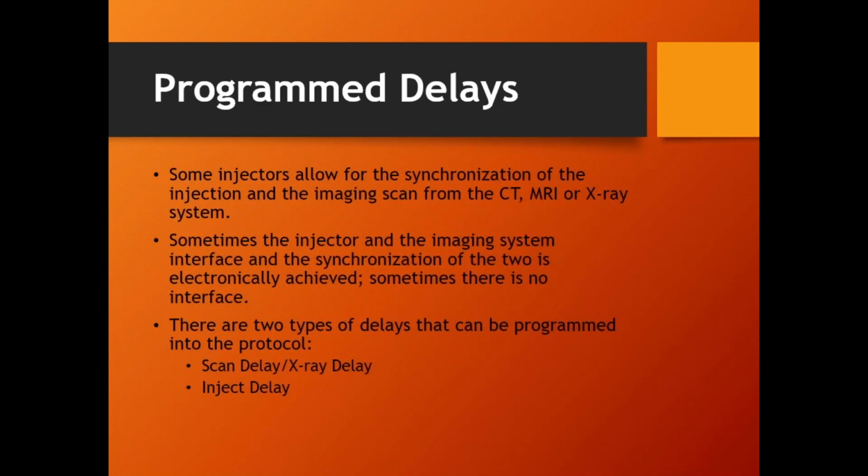Delays. So the contrast injector, remember there's the contrast injector and there's the imaging system, whether it's angio, CT, or MRI. We don't always want the two of them to start at the same time, all right? Sometimes we do. I want the X-ray system or the imaging system to start doing its thing, and I want the injector to start doing its thing simultaneously, but sometimes they don't. As a matter of fact, most of the time they don't. I want one to start and then the other one to start so many seconds later.